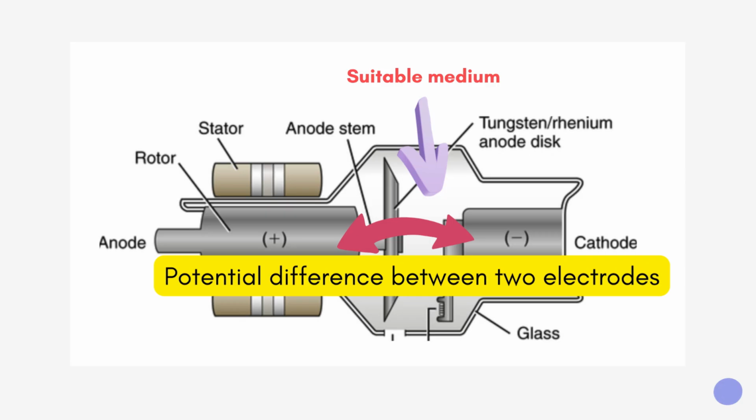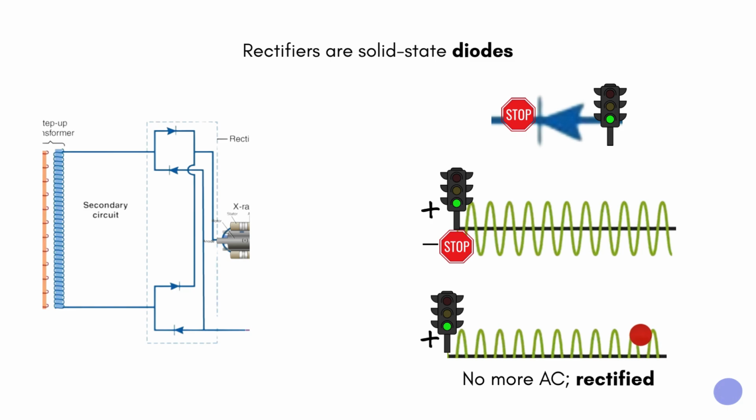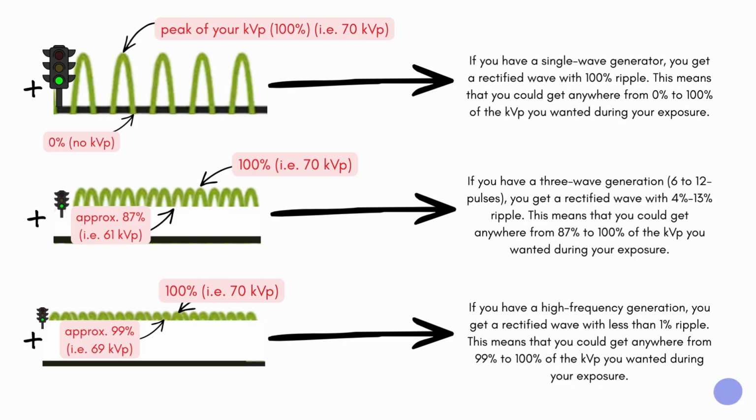Now, one thing I forgot to mention. Okay, so if we go, where was it? It was here. So when you get to this page, notice how this red dot is pulsing too. If you click on that, and these aren't working in my presentation mode, but it should work for you. If you click on that red dot, you'll get this screen. I know this has a lot of stuff on it, but I'm going to walk you through it real fast.